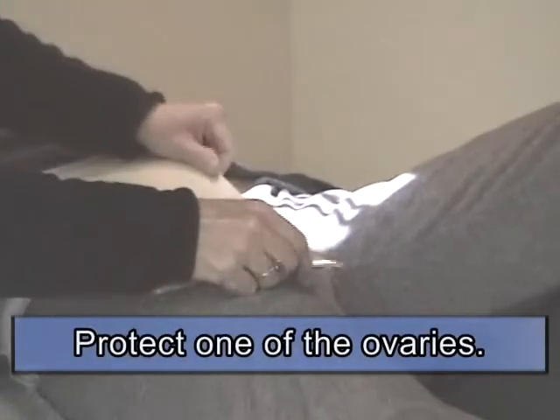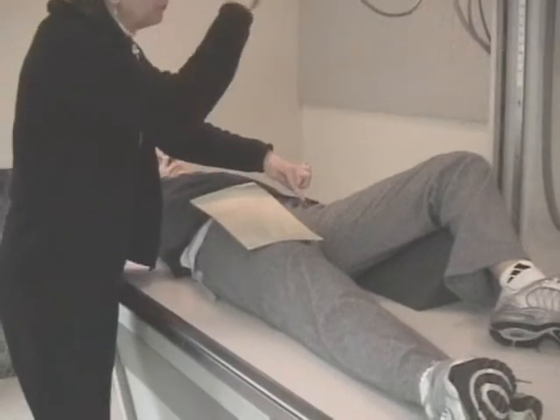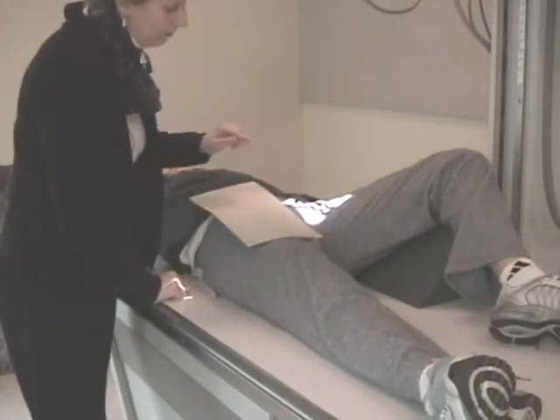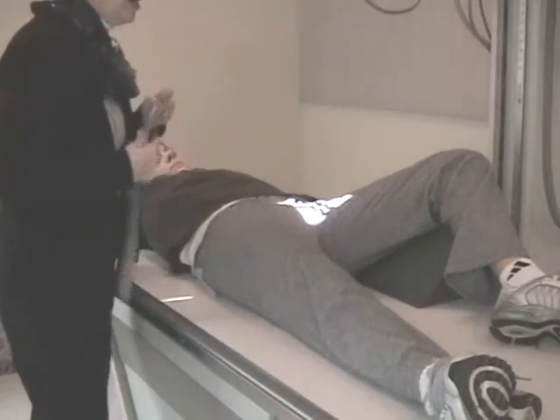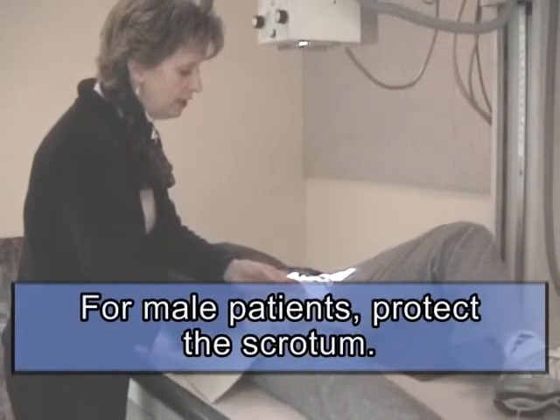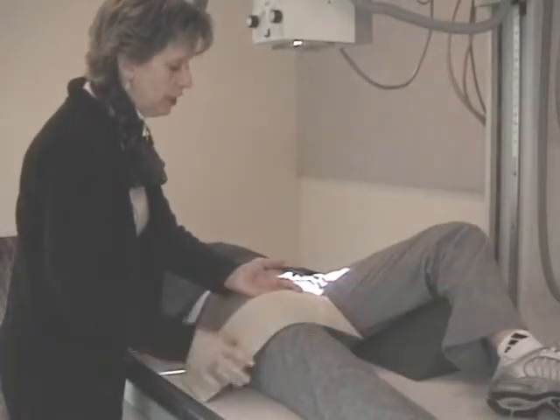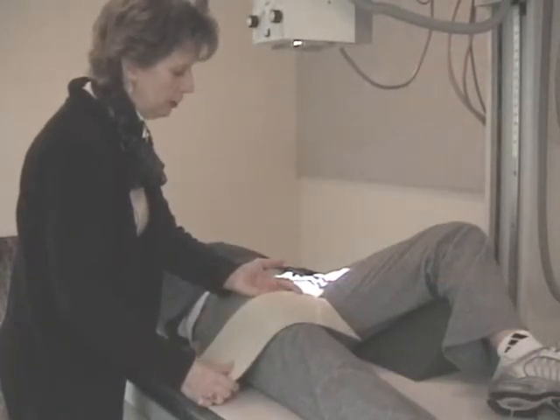I'm going to want to protect one of the ovaries. I cannot protect the other one because it is right there. Okay? A male patient on a pelvis exam, you can protect the scrotum. On a female, unless you had a shadow shield or an appropriate heart-shaped shield, you would not be able to shield an AP pelvis.